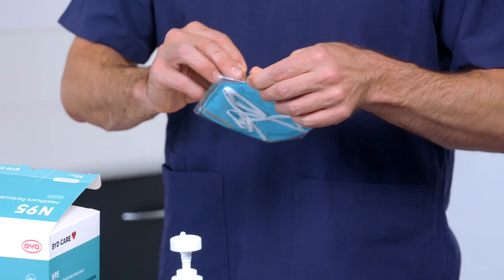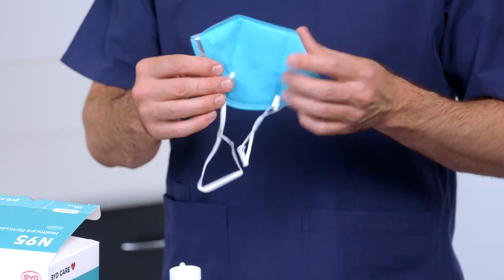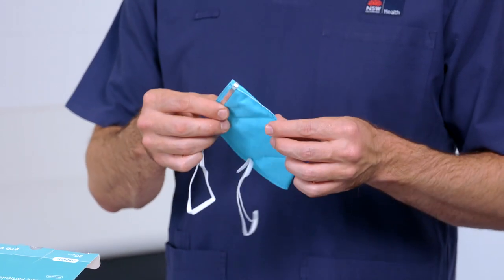To don the respirator, remove the respirator from its packaging and inspect all respirator components for damage prior to use.